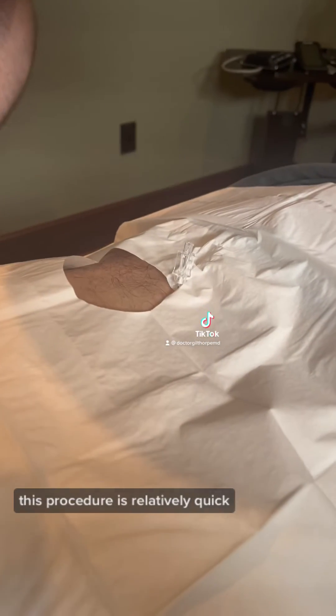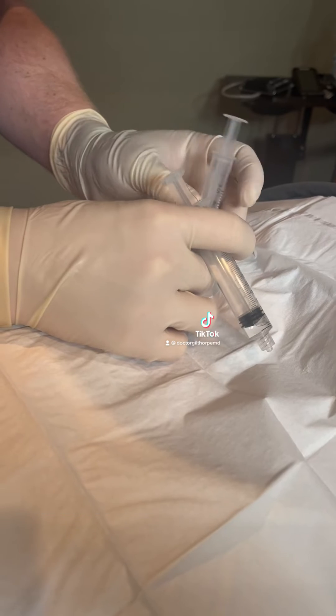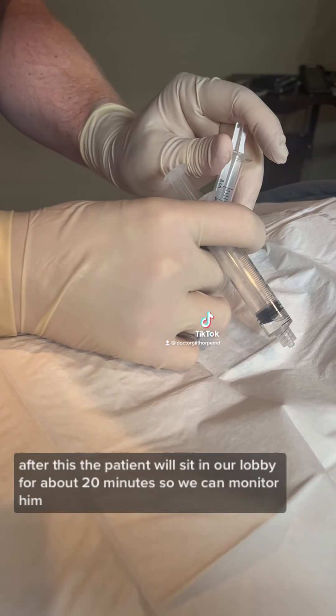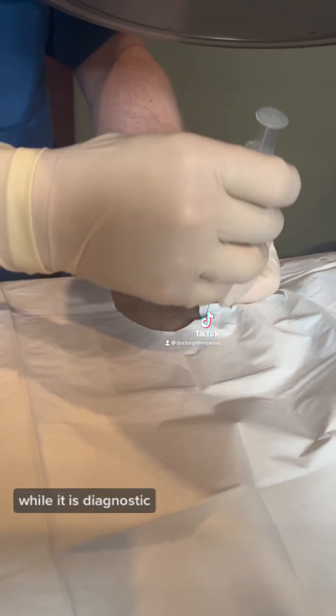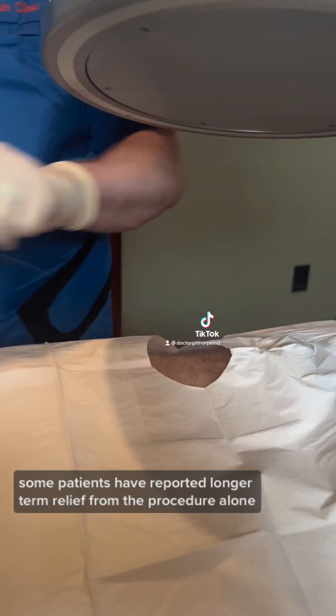This procedure is relatively quick and is done all in-office. After this, the patient will sit in our lobby for about 20 minutes so we can monitor him. While it is diagnostic, some patients have reported longer-term relief from the procedure alone.